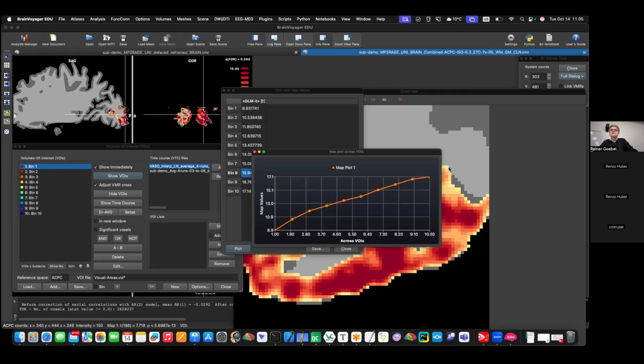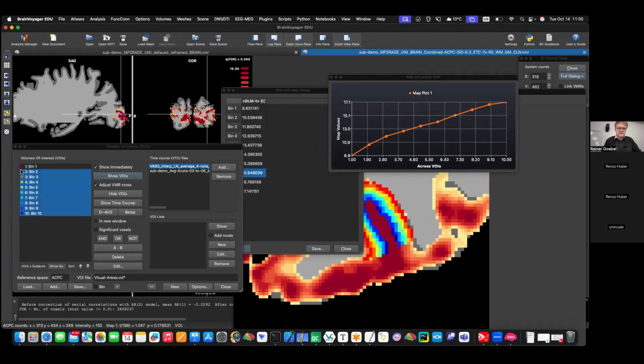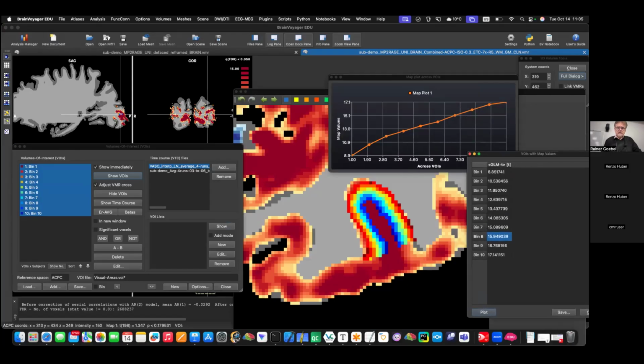So in the layer map or layer output, you showed in the underlay before, the bin number 1, for example, was pretty sparse, right? Yeah. So this is a viewing thing, right? Or is it really the case that there are just 3 voxels that contribute to the most left point here?